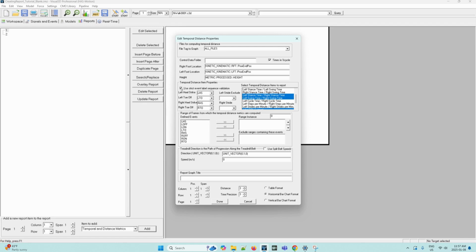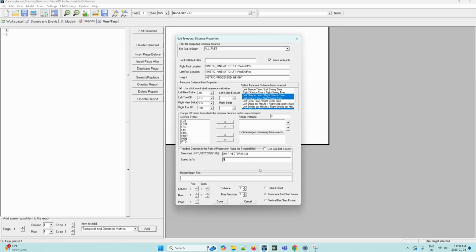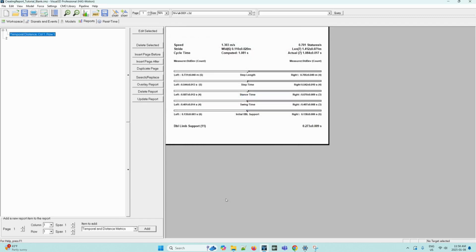A note for if your subject is walking on a treadmill, the treadmill speed must be entered in this window here. The direction of the treadmill should indicate which direction the subject would have been progressing in the lab if there was no treadmill. So in your case, if your experiment includes a treadmill, then you would have to edit the information in this specific tab. Now we can click done and the following chart will appear on page one of the report.